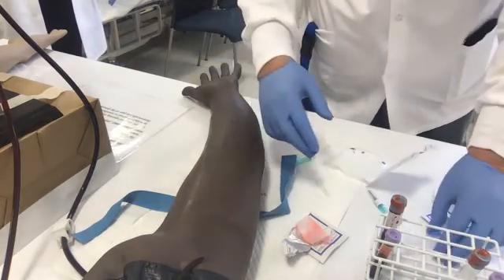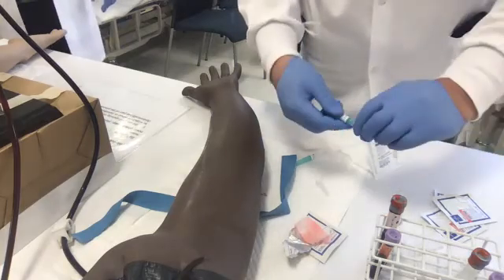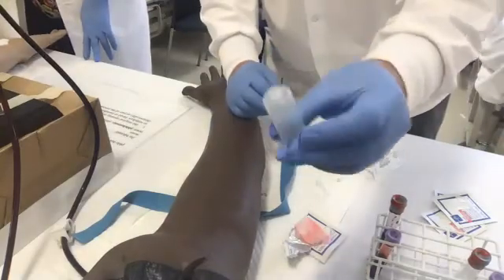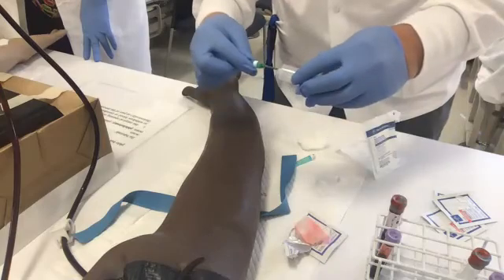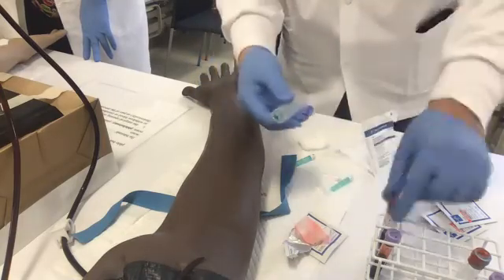So after all that's said and done, I take the things that I need to take, and then I remove them. Now, here's another old school thing that maybe you might see in the real world. Sometimes you can use these barrels 2 or 3 times as long as there's no blood in it. So let's say I use this barrel and then I want to reuse it, right? I capped it. I did what I had to do.